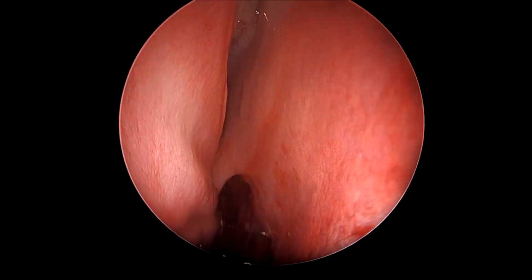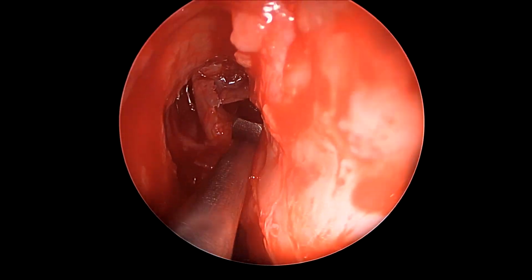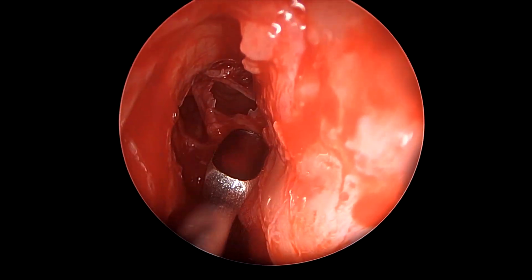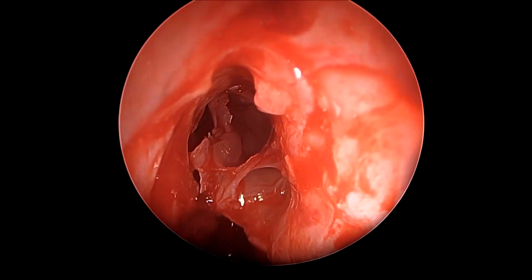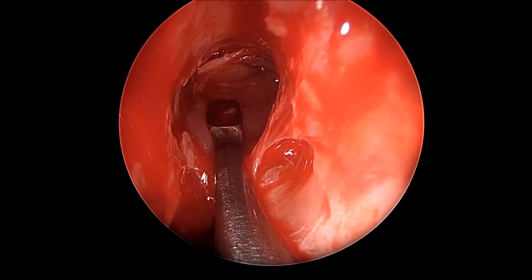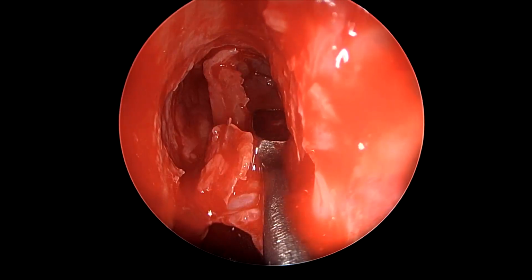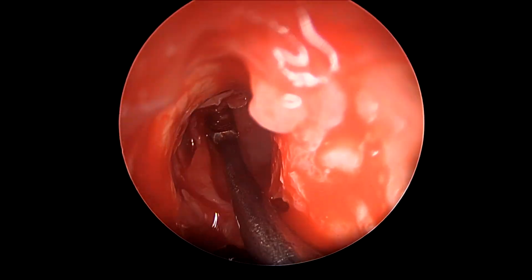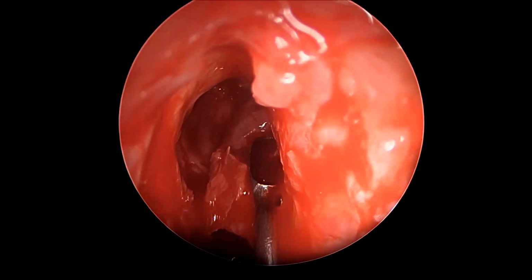So here we use a curette to be able to identify clearly. Like you see here, both the walls of this cell are now clearly visible. And you can see the walls of this cell that was occluding the frontal sinus per se on the left side. And this has been completely loosened, but still is attached a little bit towards the posterior wall of the frontal sinus.